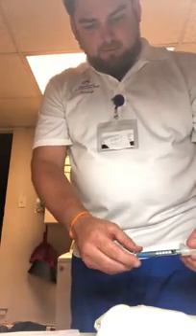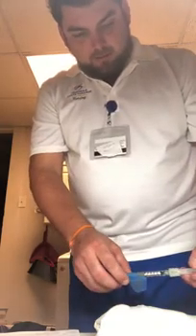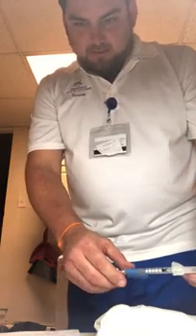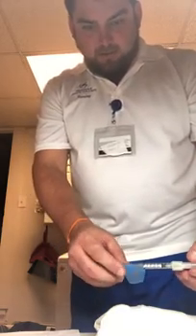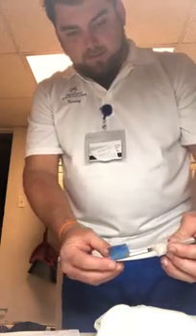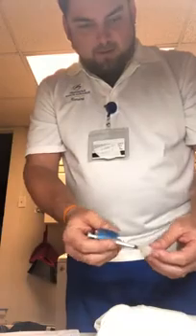I'm going to gather my other supplies. I've got 2 1 ml syringes. For the first one, the intramuscular injection for the influenza, we'll be doing the 1 ml syringe with a 1-inch, 21 gauge needle, and this will be given at a 90 degree. And then for the other one, the 1 ml syringe, we're going to be doing a little smaller needle. It's a 5/8 inch 25 gauge that can be given at 90 or 45.